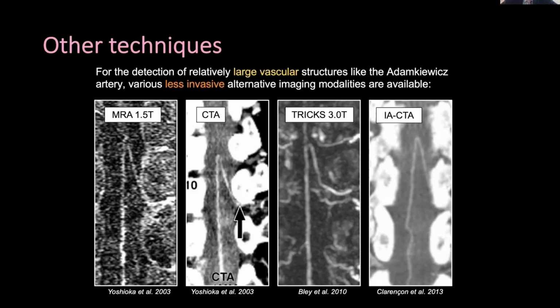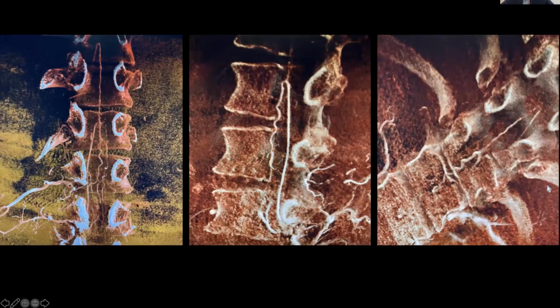That often would get, well, not always, but probably the majority of the time when there is a dural AVF, we'll be able to see the feeder on the MRA. And then that will allow us to do a limited angiogram rather than doing an angiogram of the whole spine, which is obviously preferential for the patient.